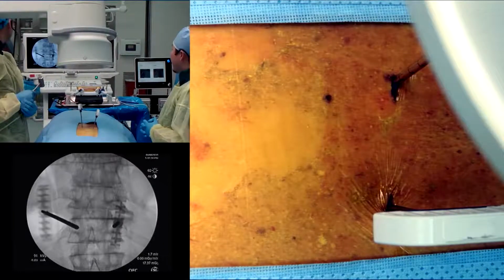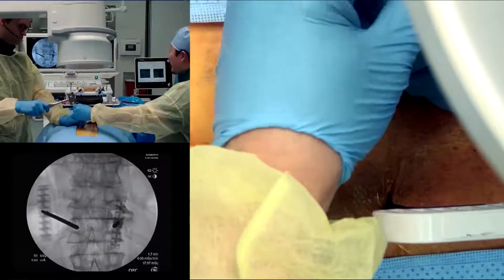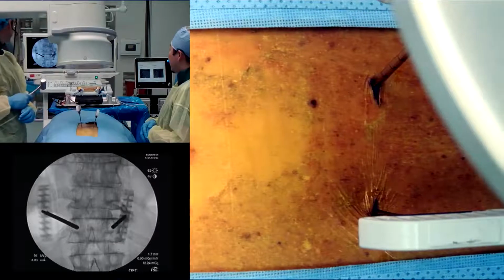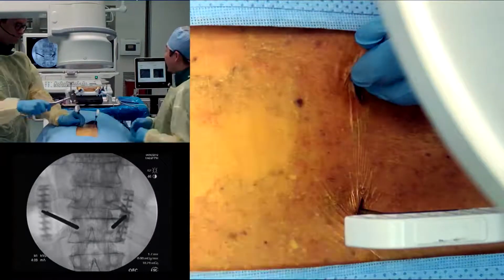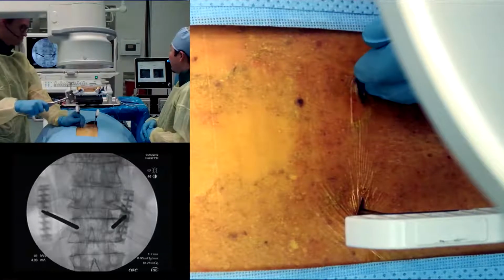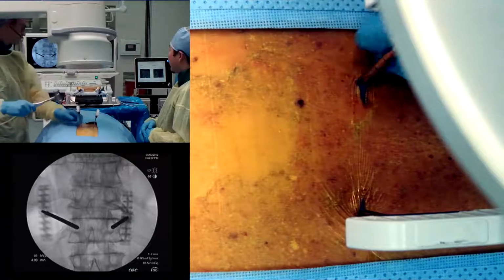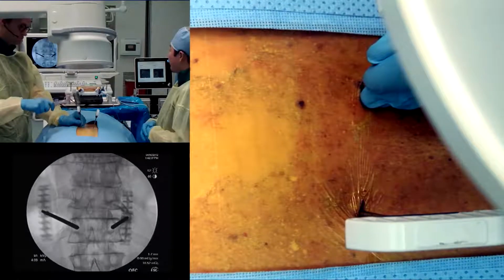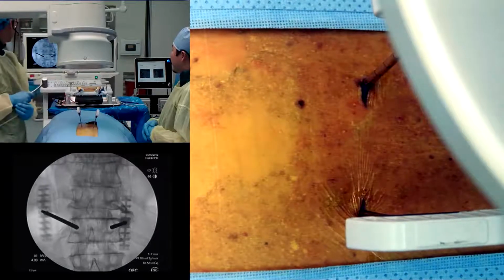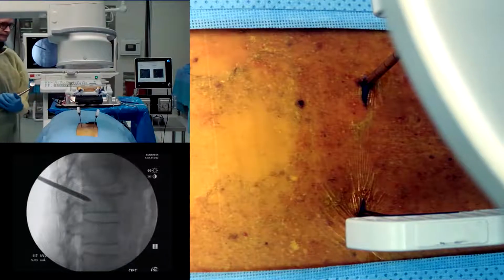Shot. And go more medial. So maybe this way, yep. Shot there. Yep, that looks good. And then go a little bit more cranial, slightly more cranial. Shot. That looks good. I would go a little bit more now, yep. Shot there. That looks great. Okay, and then go to a lateral. So we'll see where we're at on this lateral view now.